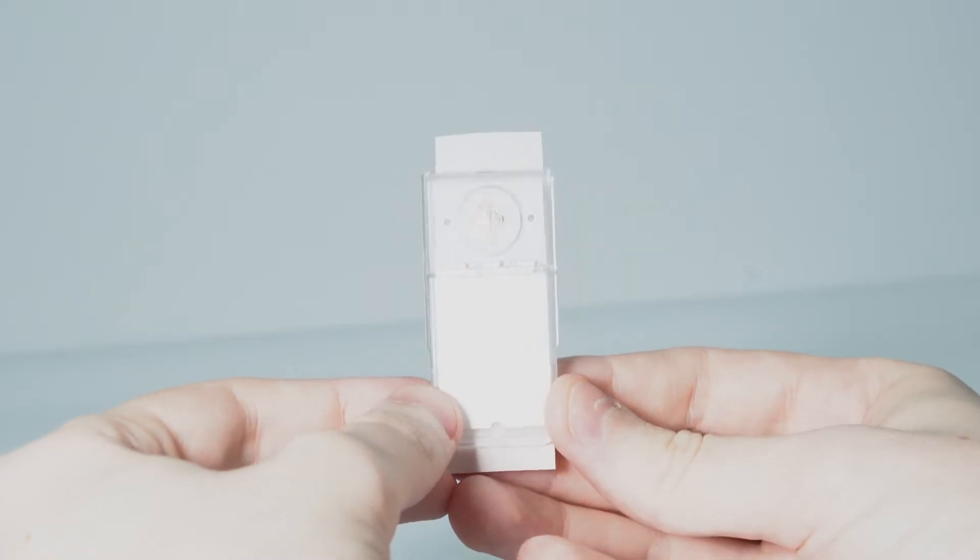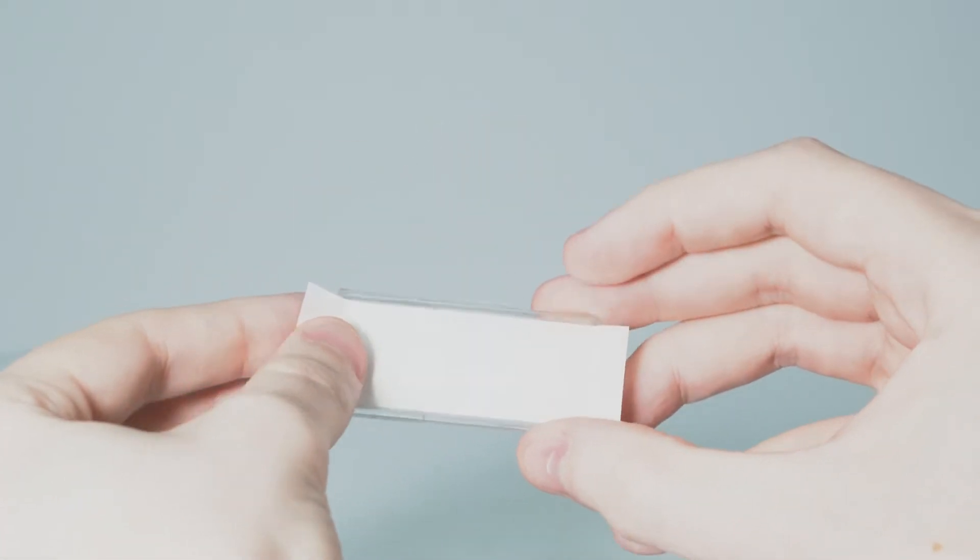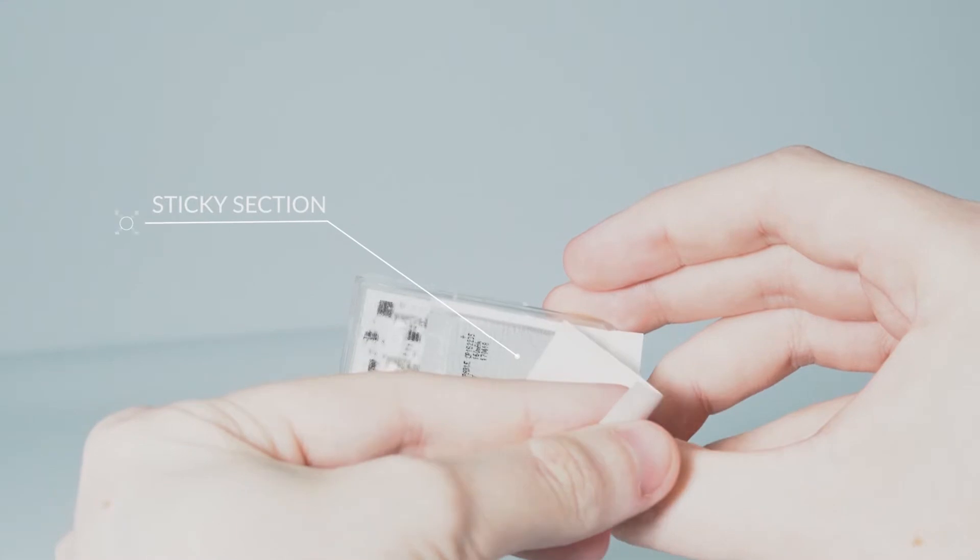Once opened, you'll see the sticky section is covered. When you're ready, peel back the cover to expose the adhesive.